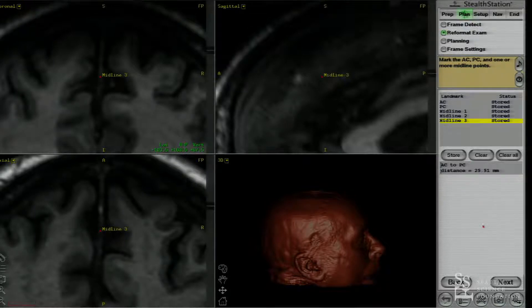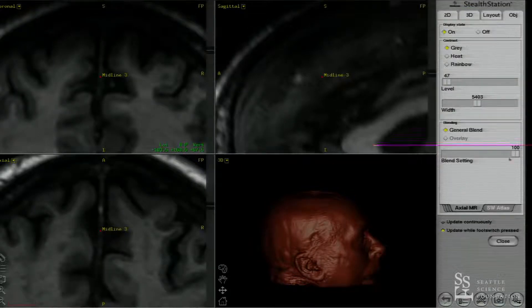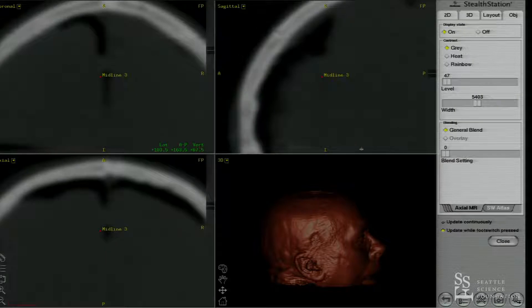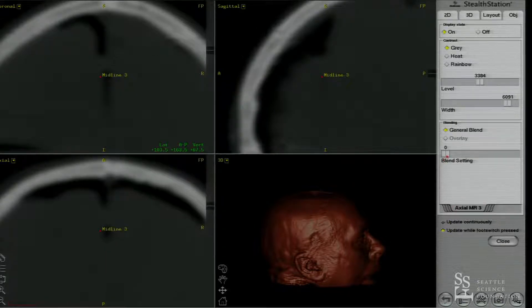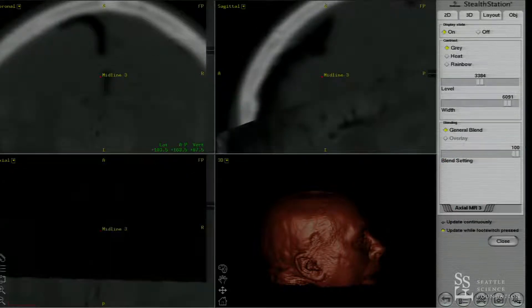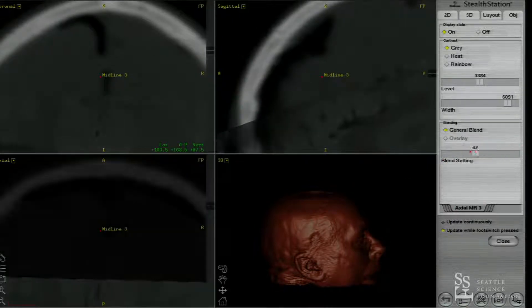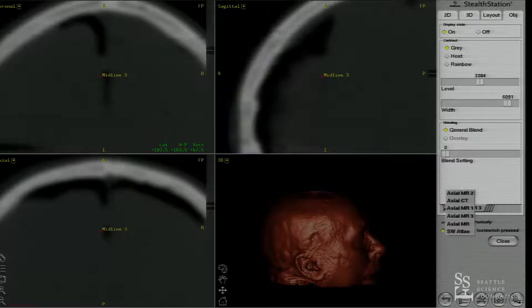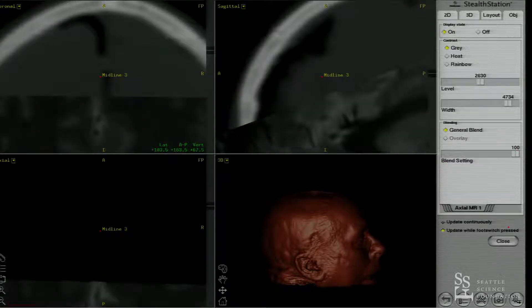So once we have that, we have our T1 MRI. There's our CT scan. That's a proton density. And here is a T2.